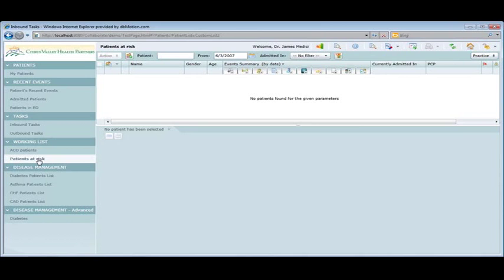If so, what that is, in the Collaborate model, was, organizationally, an organization could set a view, a population, whatever they want. Is that right, Kate? I unmuted her. So Sherry, who is it? Susan Snyder. Susan, I think you're unmuted if you want to go ahead and talk now. So I'm just curious on what populates that and where that information is coming from.